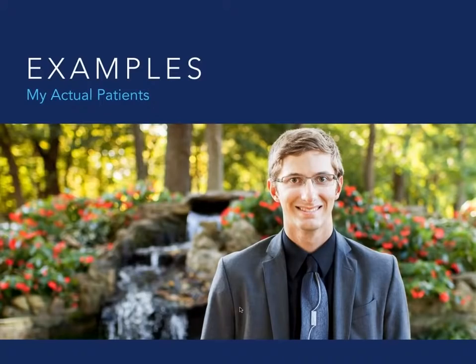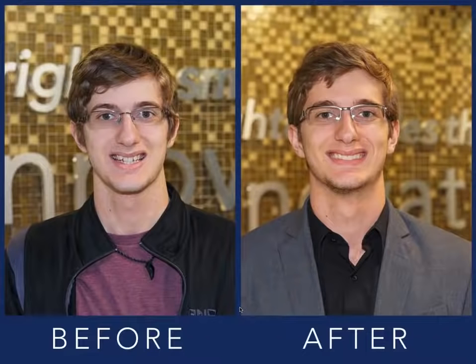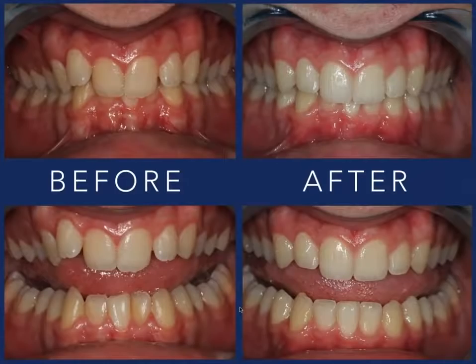I know that's a real common question. It's always a common question I've had when it comes to how quickly we can move teeth. So here's the before and after for this patient. You can see we've got a deep bite, and some lingually tipped 8 and 9, pretty drastically there. Or actually, I don't know if they were a full crossbite. I think here we go. No, they weren't. They were just a very large deep bite. A lot of crowding happening here.